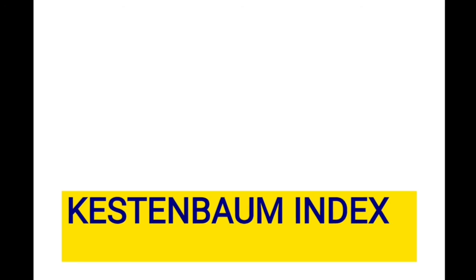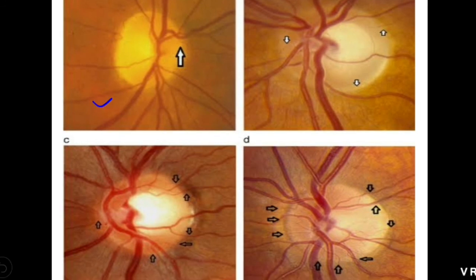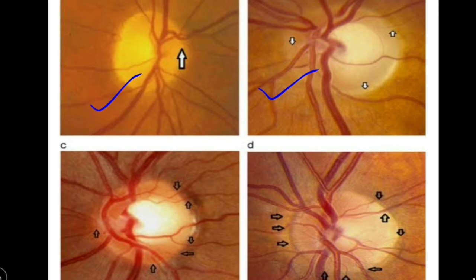It is nothing but the number of capillaries which are counted over the optic disc. Literally, you should count the capillaries when you examine the optic disc using slit lamp biomicroscopy. Normal is up to 10. In optic atrophy, as you can see in these two pictures, the capillary count will be decreased to less than 6, and in case of hyperemia of the disc, the capillary count will be more than 12. So this will be helpful when you are following up the patient.